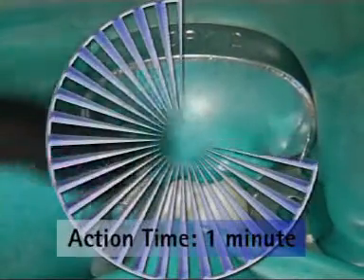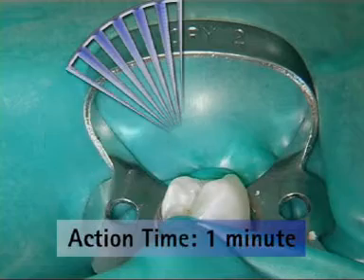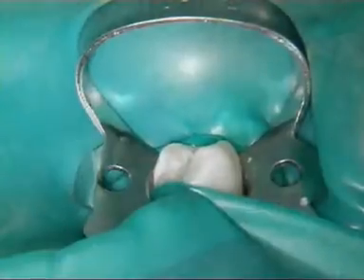Apply the first adhesive layer, blow a short blast of air onto it and leave to stand for one minute. Apply the second adhesive layer, blow air onto it and again leave to stand for one minute.